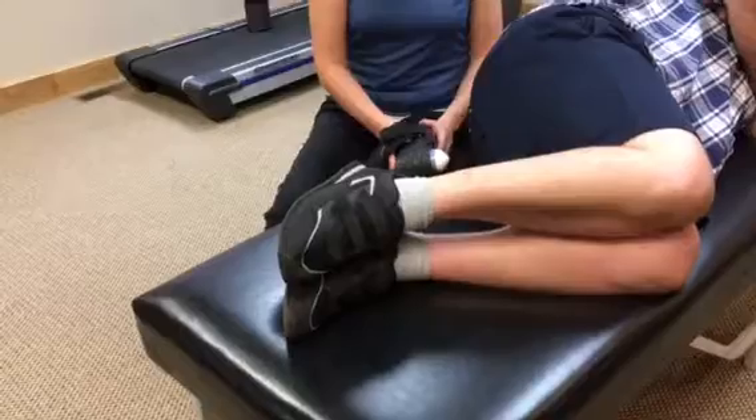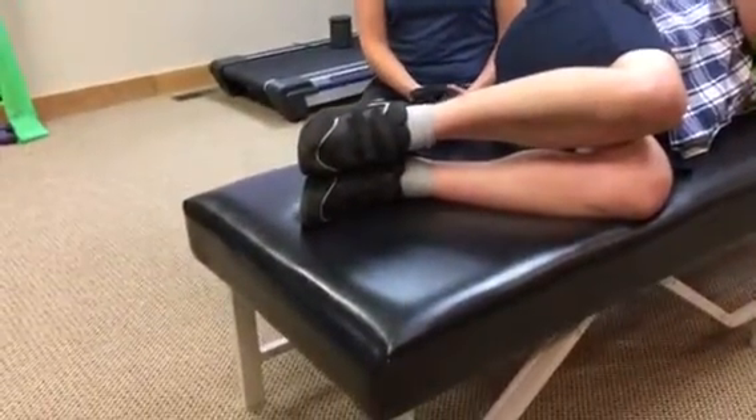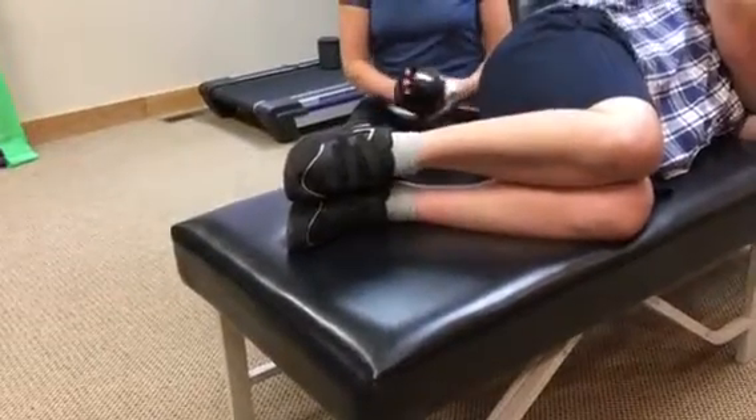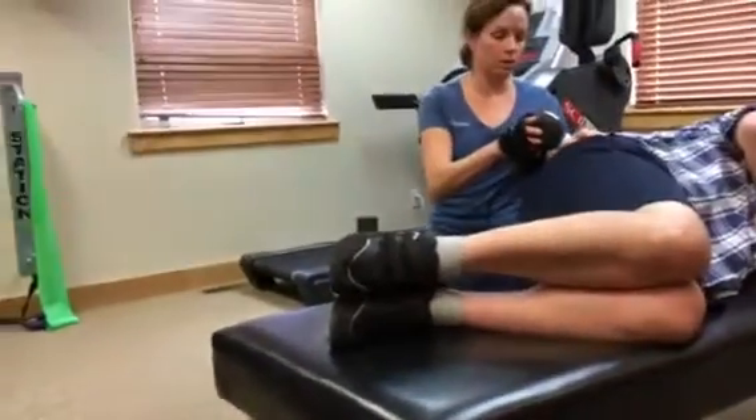And then we'll go ahead and try one more time, Jeff. Now I'm going to apply the treatment technique with the fascia manipulator right here on the gluteus muscle.